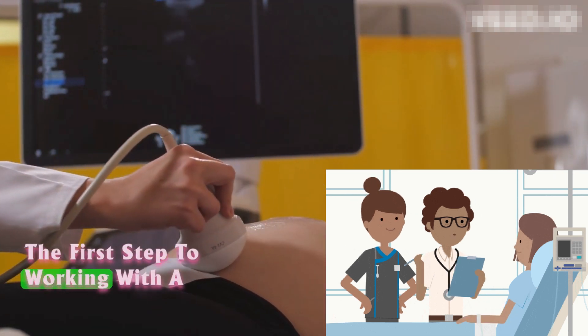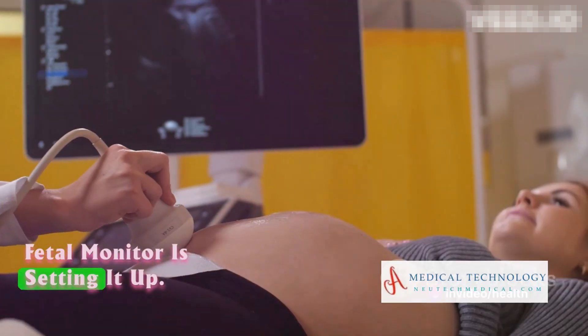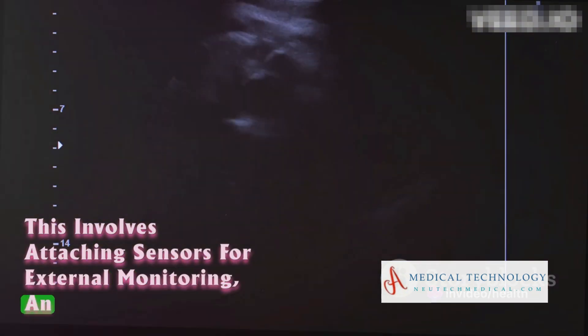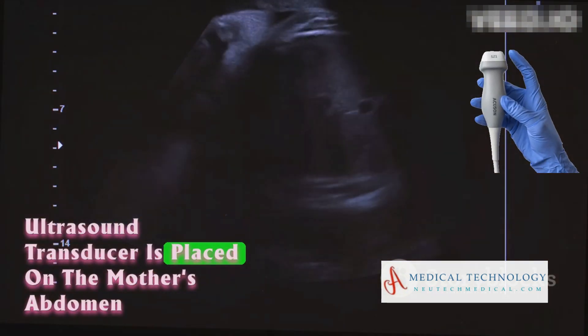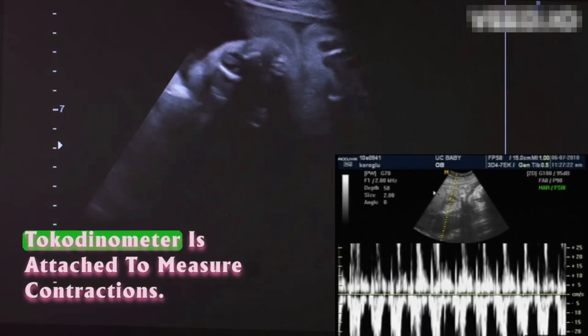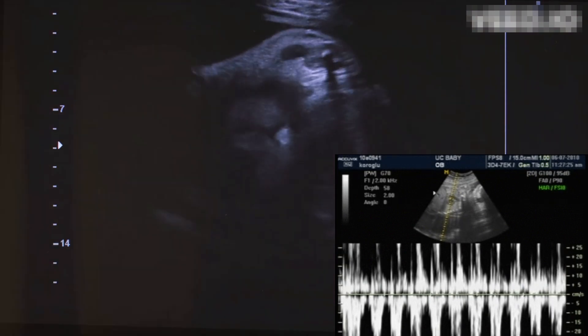The first step to working with a fetal monitor is setting it up. This involves attaching sensors. For external monitoring, an ultrasound transducer is placed on the mother's abdomen to pick up the fetal heartbeat, and a tokodynamometer is attached to measure contractions.